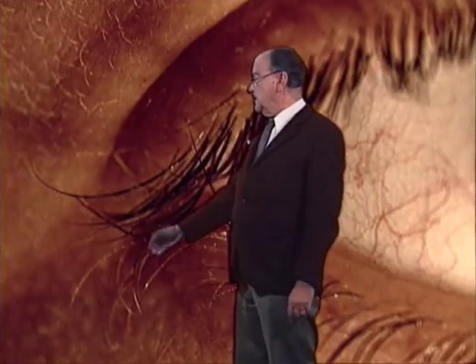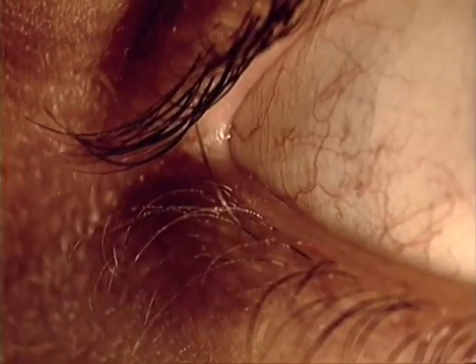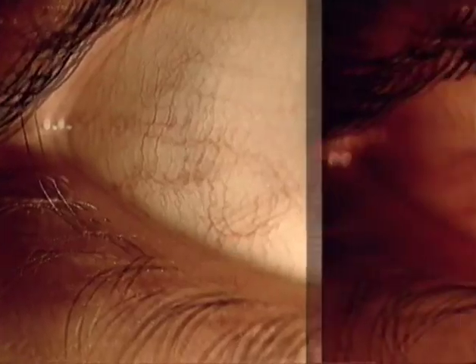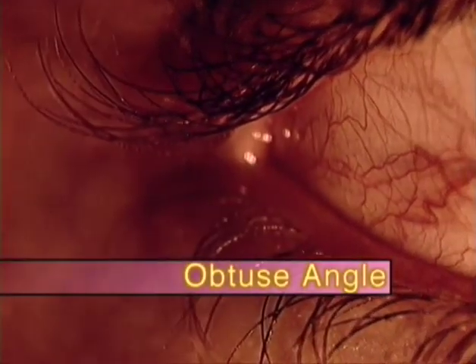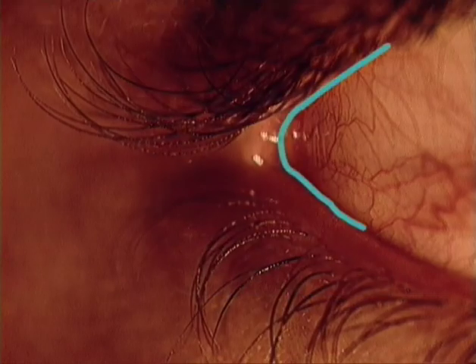Anomalies at the lateral canthus may impair complete lid closure. Unfortunately, they are easily overlooked, as in all other aspects the lids may appear normal. The angle at the lateral end of the lid is acute in the normal eye. Here, the angle is obtuse. Thus, lid closure has been incomplete during sleep. Note how the lid margins look normal.